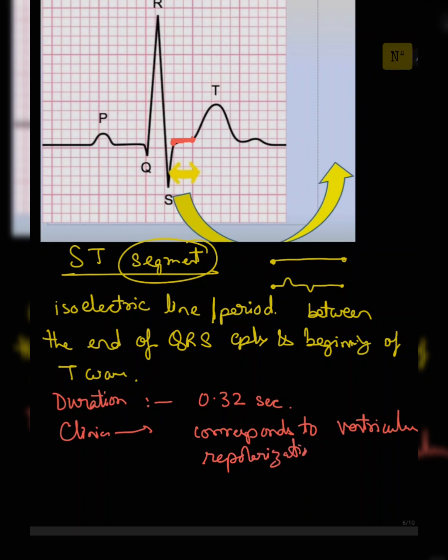That means it is the time the ventricles take to relax. Another important point while calculating the ECG cardiac axis is the J point. The junction between the isoelectric line, the ST segment, and the negative S wave is called the J point. Remember this, we are going to need it in the later calculation class.